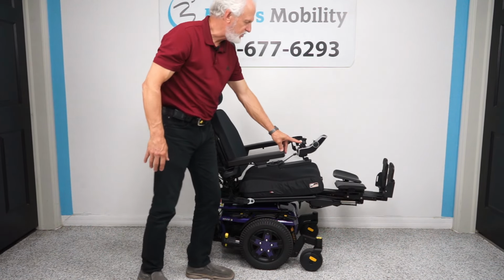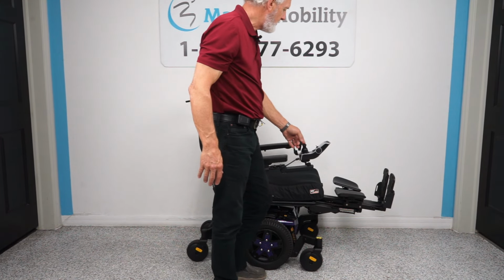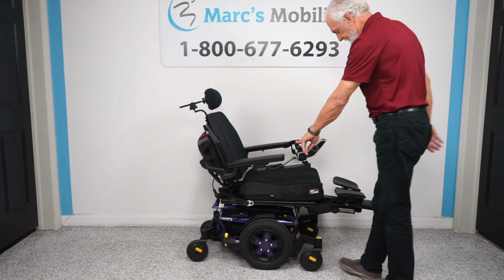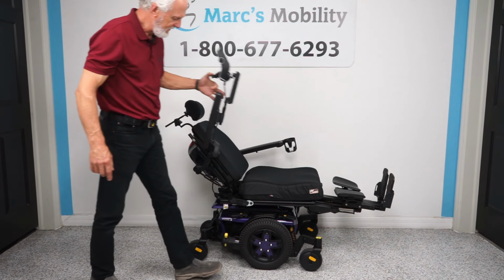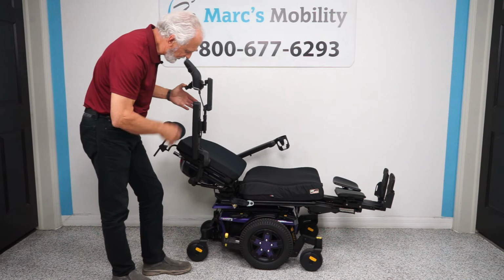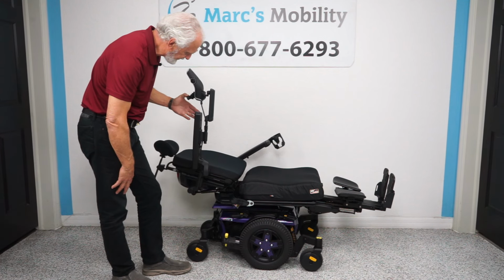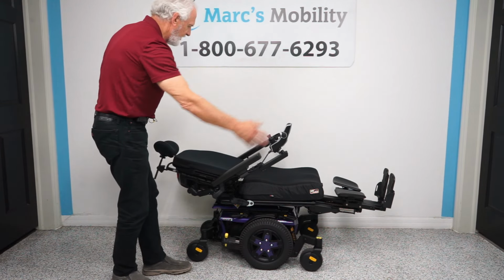And the third function is called the electric recline. So the electric recline is when the back goes back by itself. Nothing's moving, but the back is going back. Okay, so you can see the back moving down. This is called recline, okay? So we'll see how far this is going to go down. So it's pretty much flat, okay? That's your electric recline. So if you're laying in the chair, that's what it looks like.